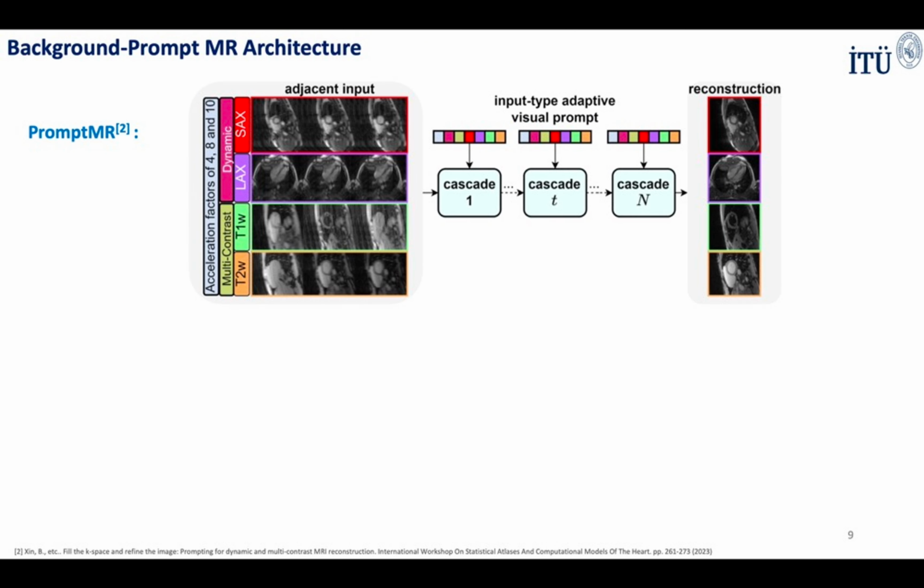Background: Prompt MR architecture. Prompt MR set the state-of-the-art for cardiac MR image reconstruction. For the previous edition of this challenge, we base our algorithm on this innovative approach and suggest improvements.